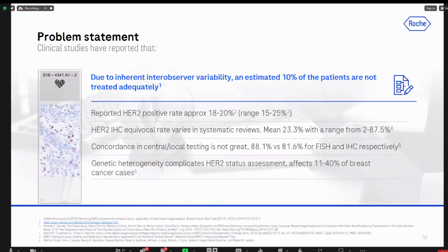to the pathologist to adhere to clinical guidelines of how to interpret things. And maybe if you're up to 90%, that's because you really feel that you want to send everything to ISH and you don't trust the IHC. The mean rate should be around 23% if we look at the whole results from all pathology labs.